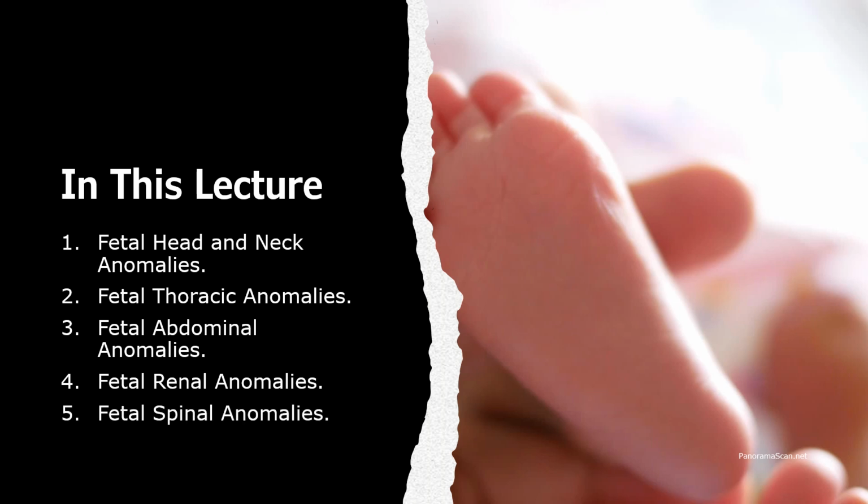Each topic will highlight the benefits of 3D and 4D imaging in visualizing and diagnosing these anomalies, showcasing real-time cases and practical applications. Let's begin by exploring the first category, head and neck abnormalities. Fetal head and neck are critical areas where 3D and 4D ultrasound have brought significant diagnostic advancements.